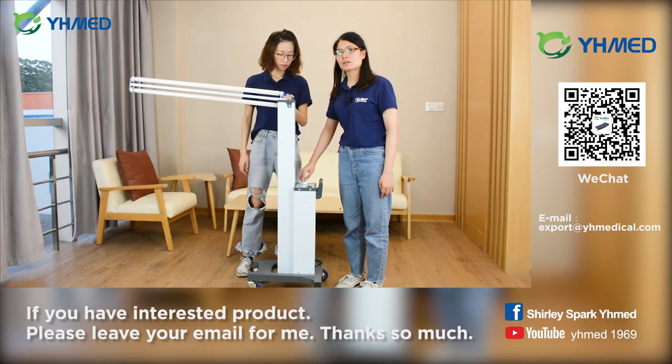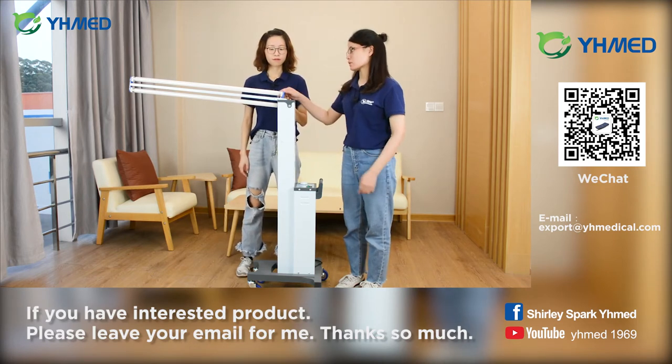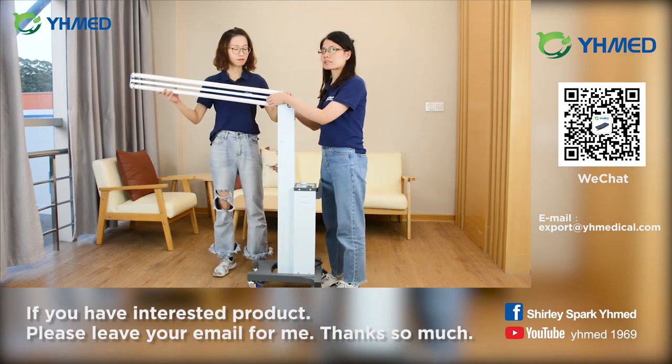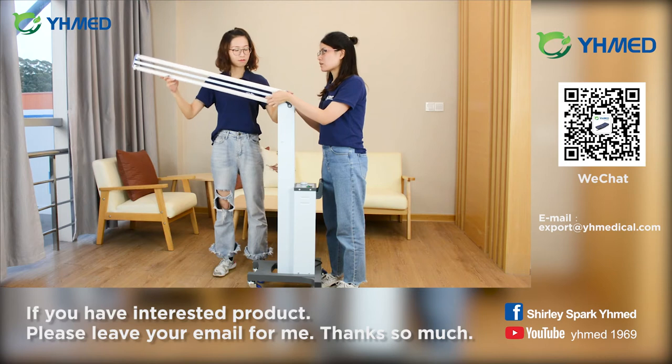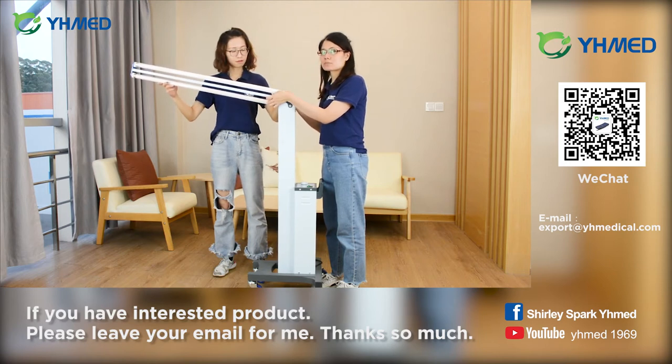It is suitable for setting the time within 60 minutes. Also, the lamp arm has multi-angle adjustment to fix, to meet different disinfection requirements.